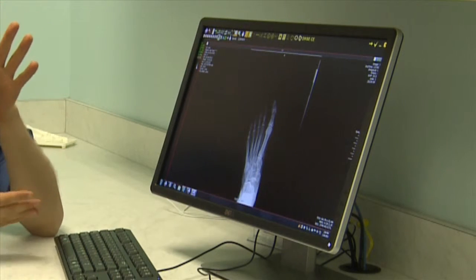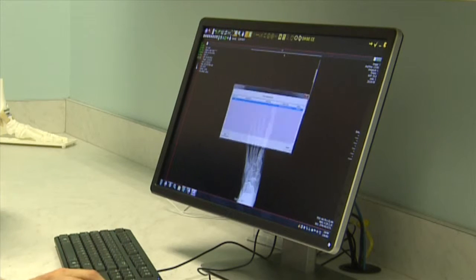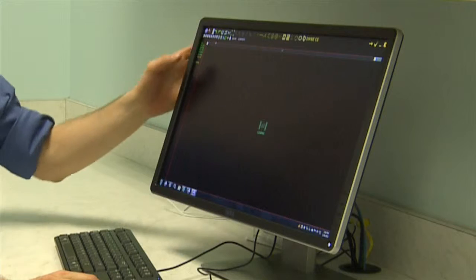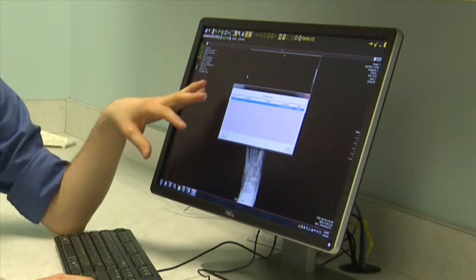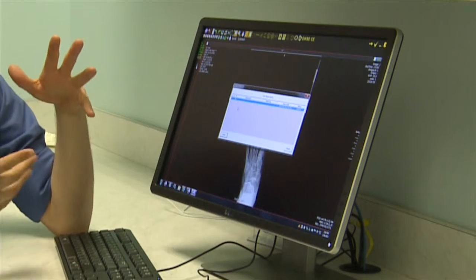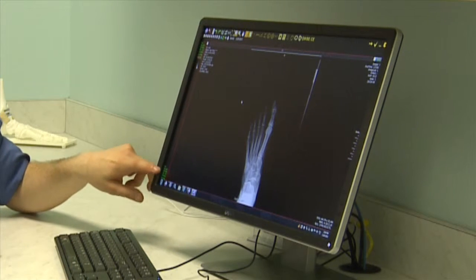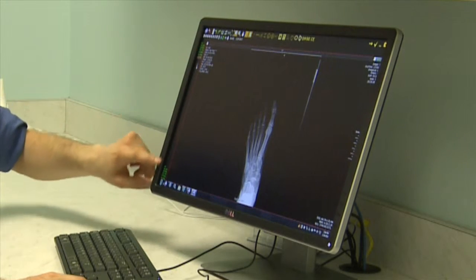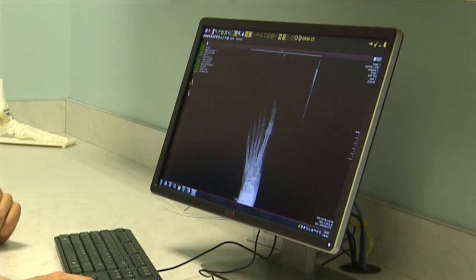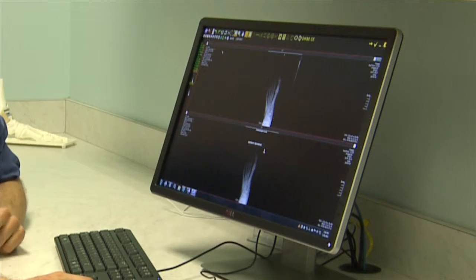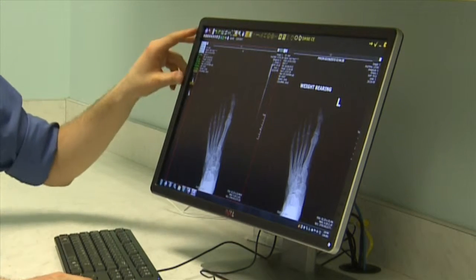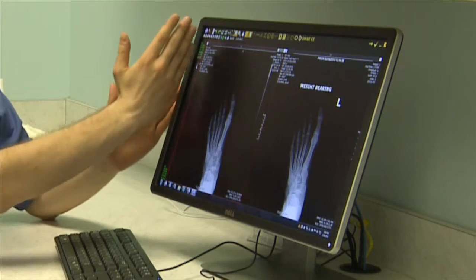Down here you have different view layouts. The Patient Priors button will appear if the patient has another study. Open that up and it shows all other available studies — simply highlight one and double-click it to load it. Now we have it loaded in the bottom left. You can push it up into its folder. Using the layout options at the top, you can go side by side. It'll only ever show one study's images on the left-hand side at a time so you don't get confused.